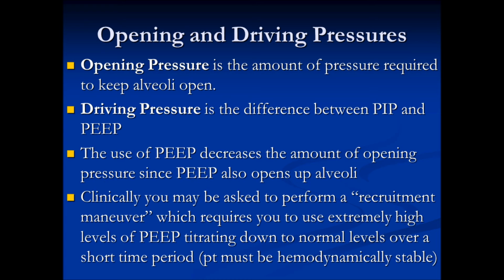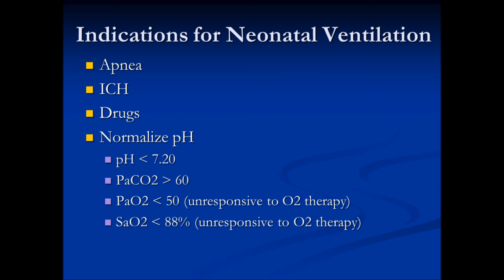So if you say, okay, every minute we're going to go down, if within 30 seconds of going up on that PEEP their pressures start to increase, then you might not want to stay at that PEEP level for a whole minute. You might want to do 30 seconds for each level. So that's called a recruitment maneuver. Opening and driving pressures are very important in neonates. Okay, indications to ventilate a neonate.